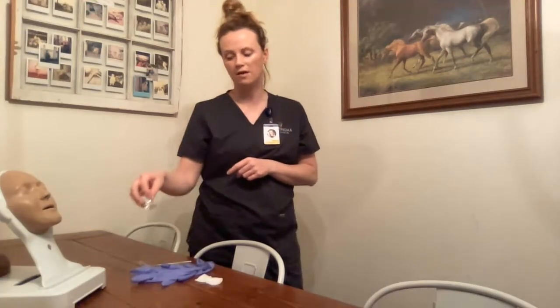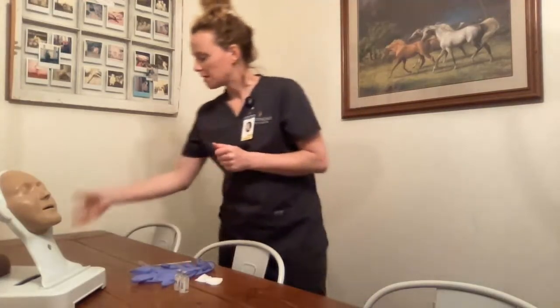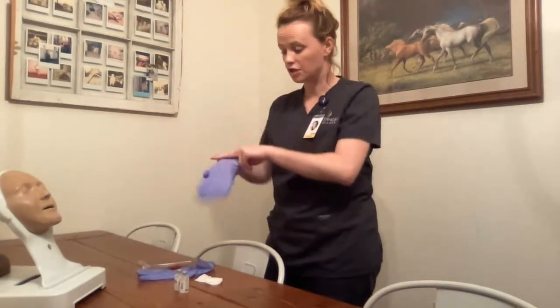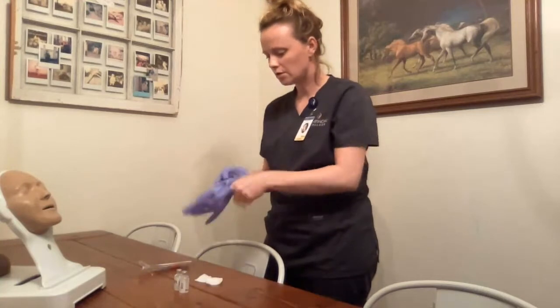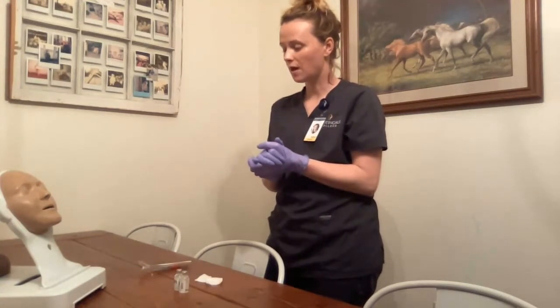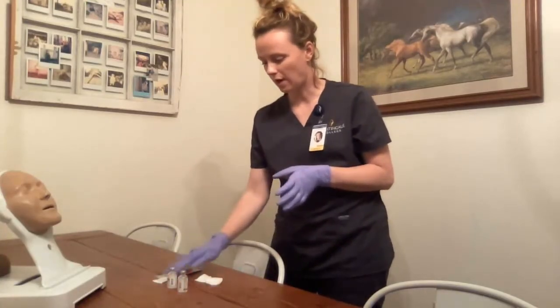I verify for a second time now that I've laid eyes on my patient. Mrs. Smith, I'm going to perform hand hygiene and put on some gloves. As you can see here, I have an injection for you. Your physician ordered you to have some medication. There are two sets here, and you're going to be receiving that in one injection, okay?